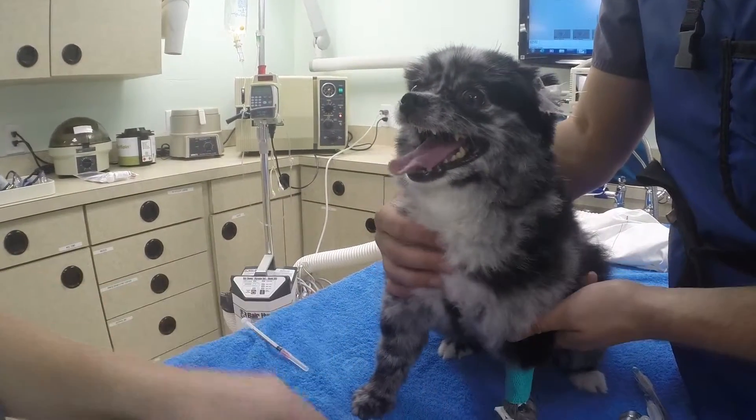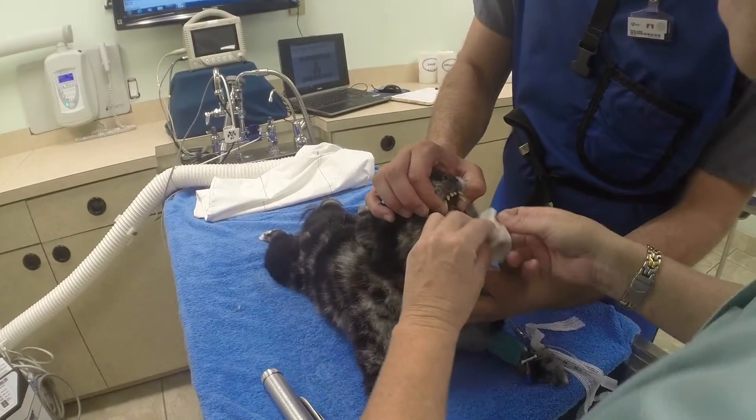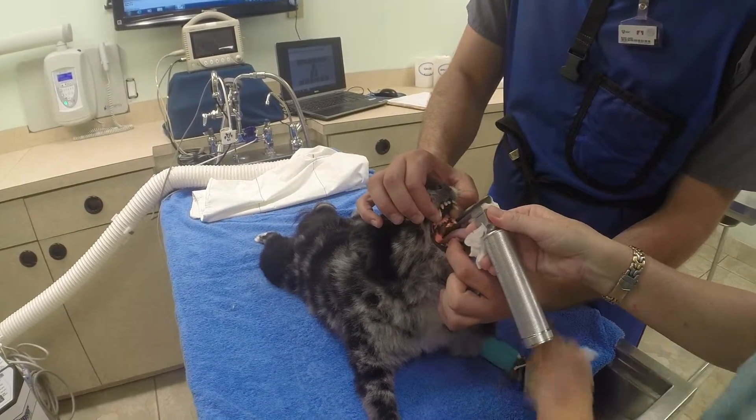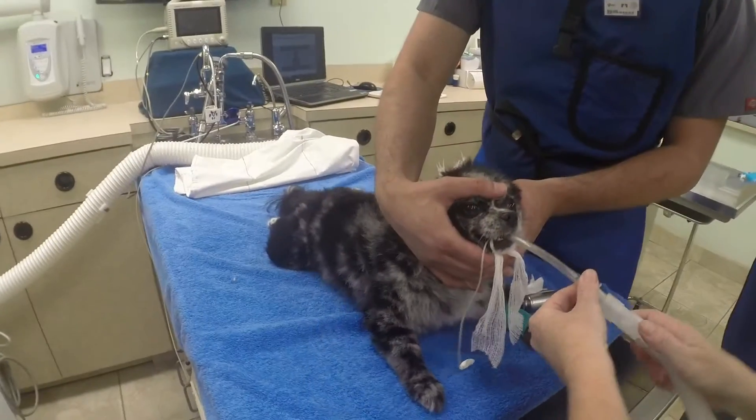This tube does two things. It controls the airway so that we don't get debris or water in the lungs during the dental procedure. It also allows us to deliver oxygen and a gas anesthetic to maintain anesthesia during the procedure.